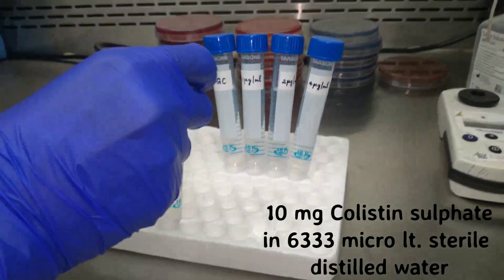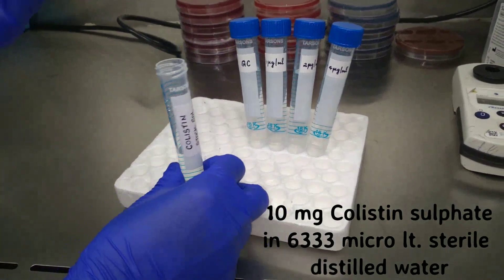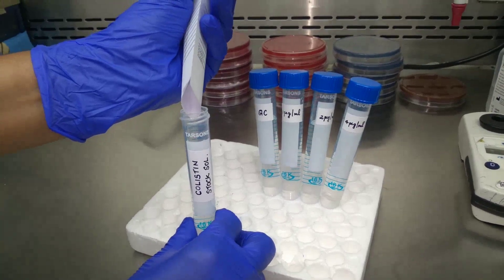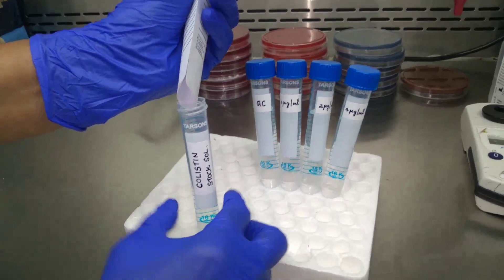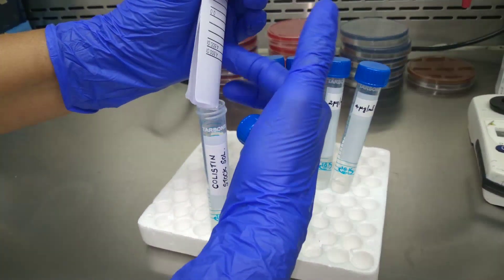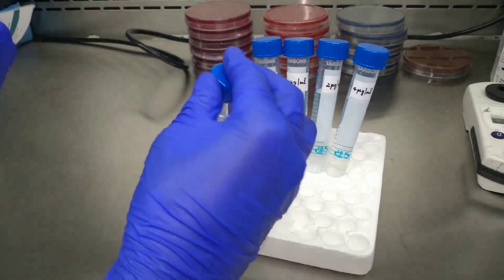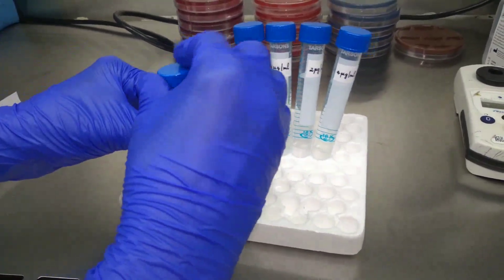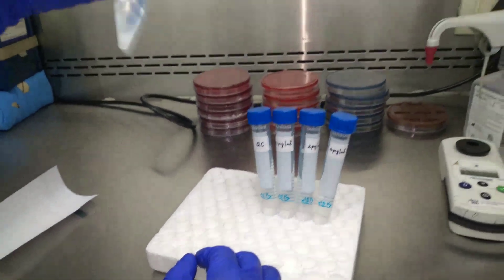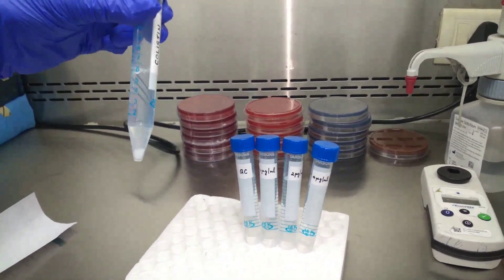For the colistin stock solution preparation, we dissolve 10 mg of colistin sulfate salt in 6333 microlitres of sterile distilled water. We are now adding the colistin sulfate salt — 10 mg — into sterile distilled water taken in a tube. Shake very well until the salt dissolves in the water.